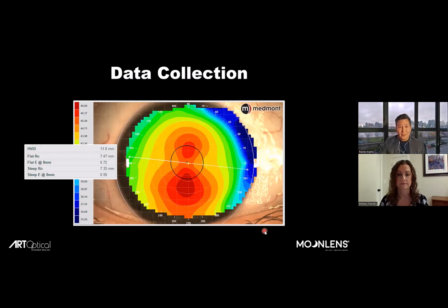My mentor had recommended that, like, let's not push it. Let's just do this another day and come back, and we're able to get an image the next time or the time after. And just that whole newness of having this instrument with all the lights, and it's invading your space. And so, considering we're often topographing mostly kids in orthokeratology, it might be helpful to get better data.